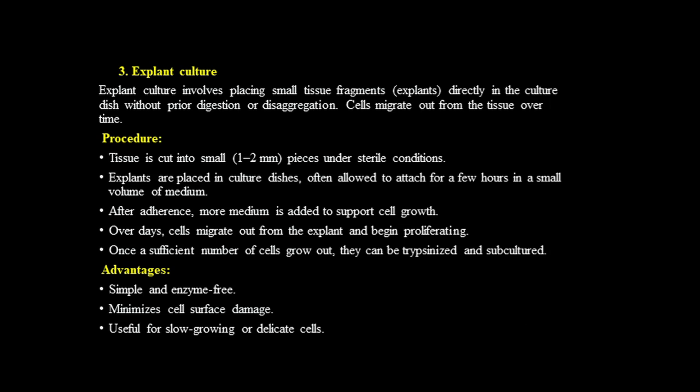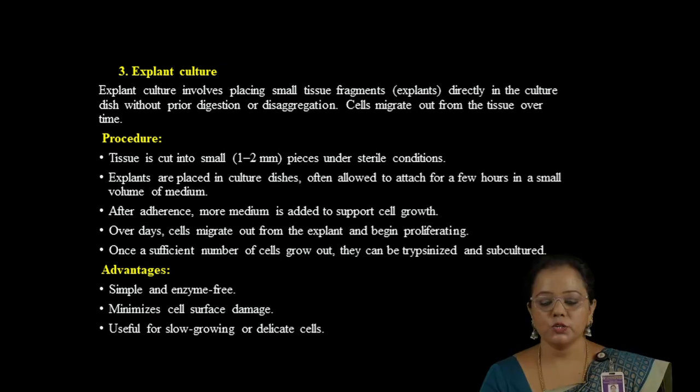Next is explant culture. Here small tissue fragments are taken in the culture dish without prior digestion or disaggregation. The cells then migrate out of the tissue over time. So it will take some time, but this procedure is very effective.